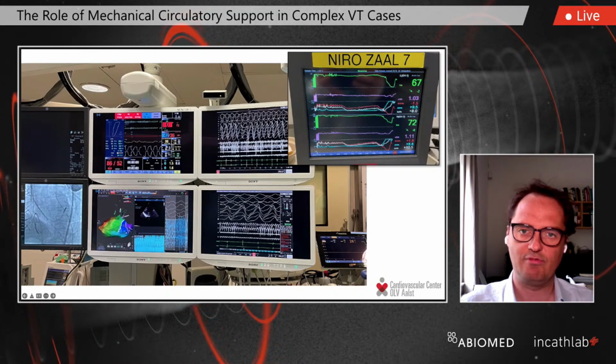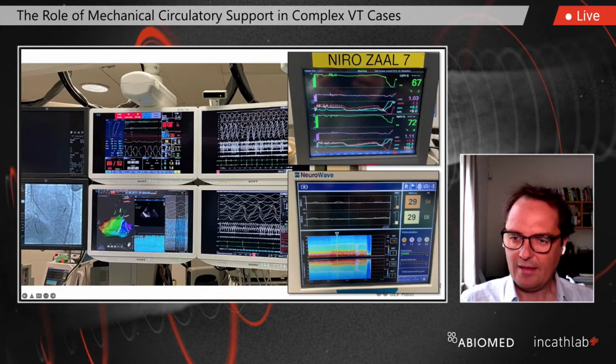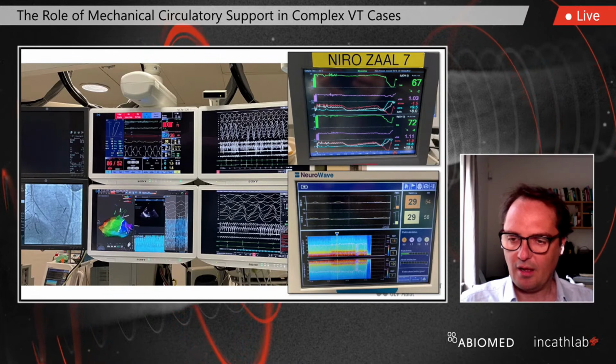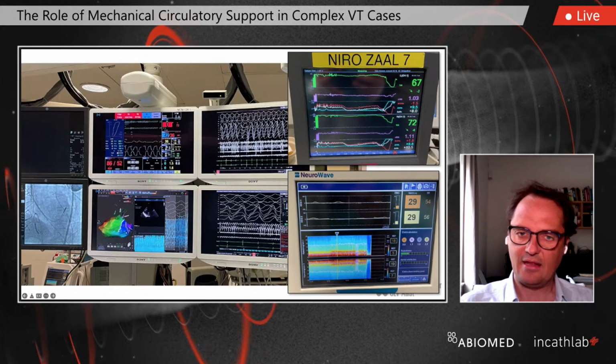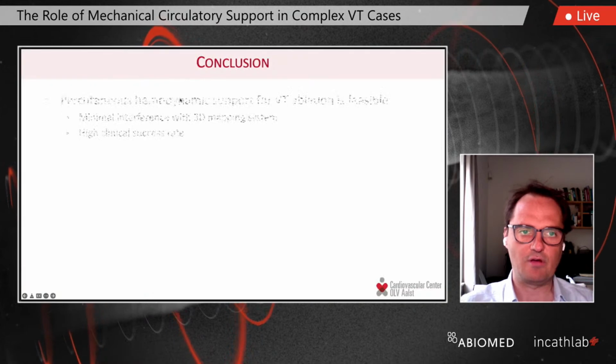Typically, it means the patient went to VF instead of VT, and you can see the correlate here as well in the spectrogram of the brain function, where at the end you can see that suddenly brain function ceases. Then of course we know we need to stop the ongoing arrhythmia and let the patient recover.